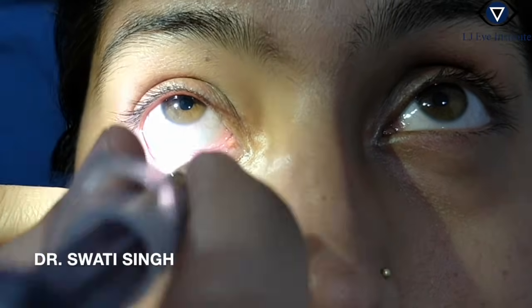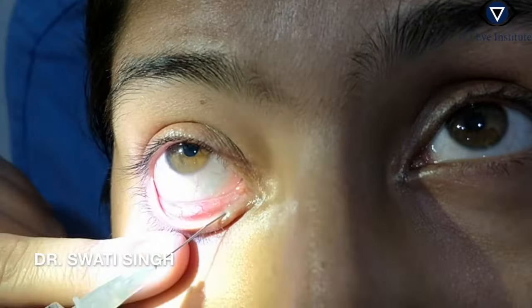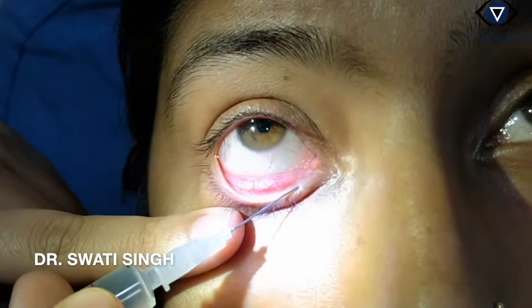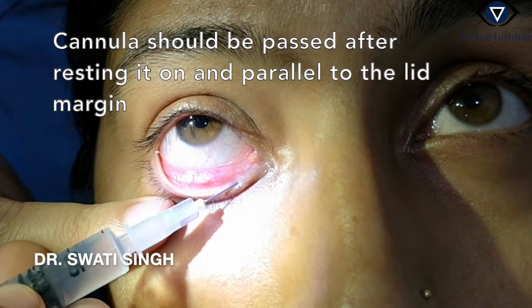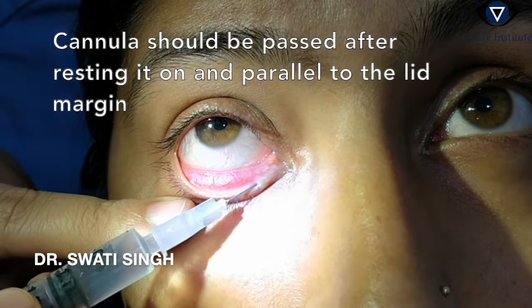Advance the cannula slowly until a stop is reached. One should feel for the stop and note whether it is soft or hard.